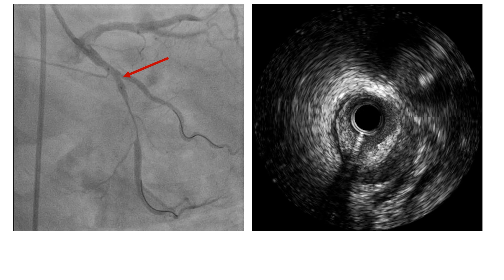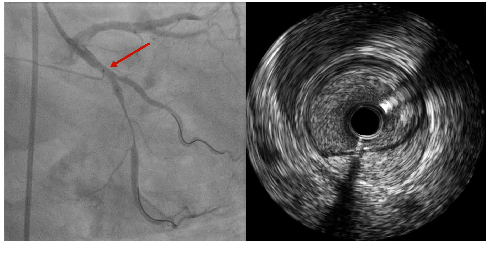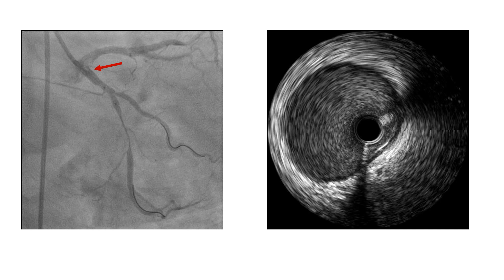Now we are at the level of the proximal bifurcation. This is the main artery with the IVUS catheter and guidewire. This is the OM branch and its wire. Proximal to the bifurcation we can clearly see the hematoma extending proximally. The proximal circumflex is clear of atherosclerosis and clear of any hematoma.